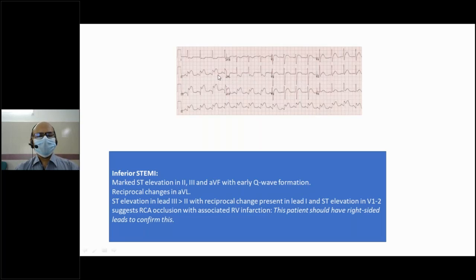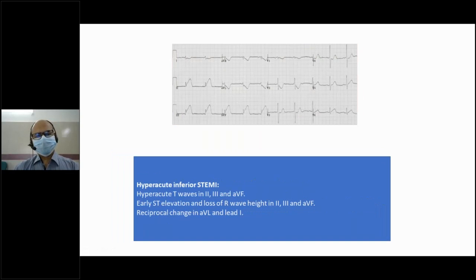And lead 1 and aVL show ST depression, reciprocal changes. You mention inferior myocardial infarction.